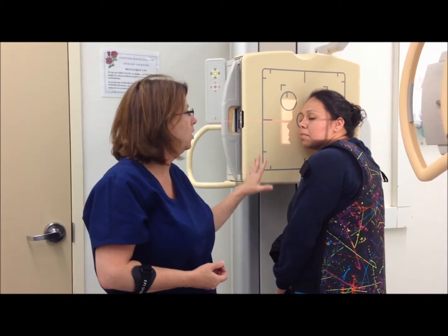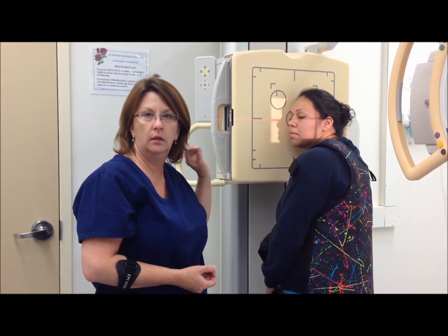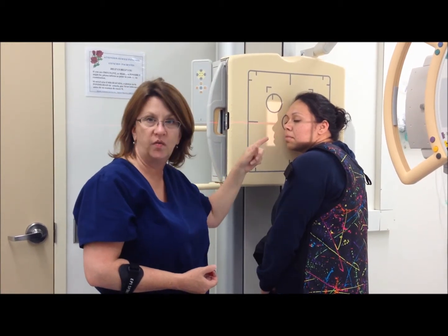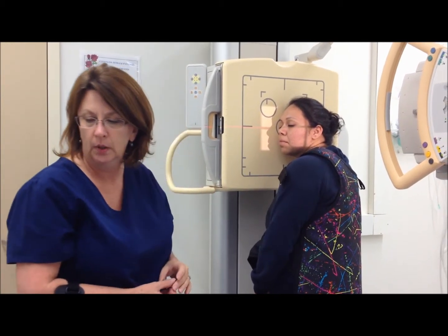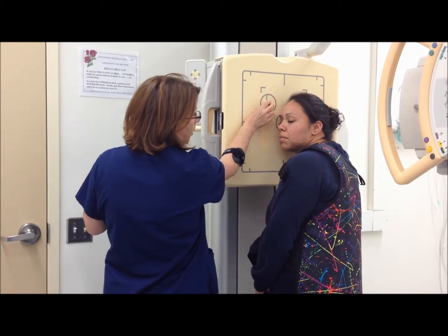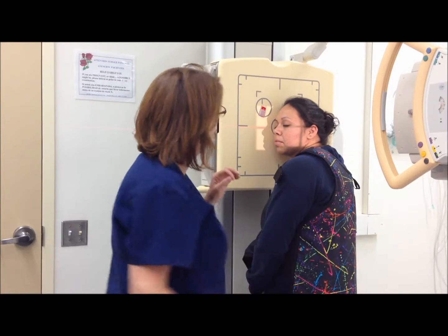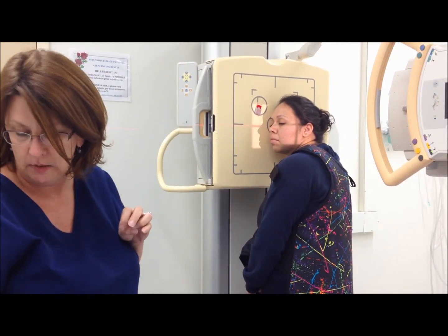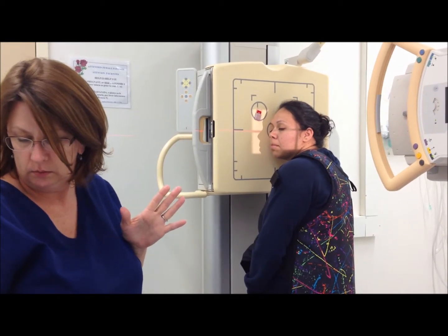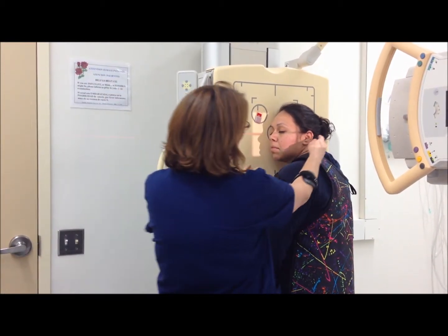We do see all 4 of the sinuses in this exam. The most important is the sphenoid that is visible in this exam. My marker, right side is against the board, so my right side marker will go into the light field adjacent to the patient's head. My IOML is horizontal.